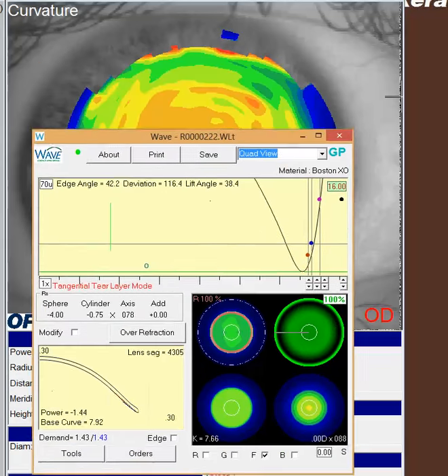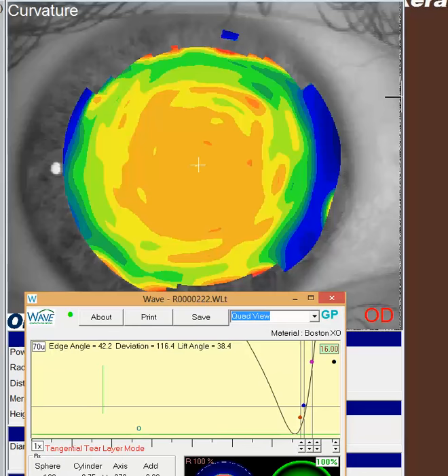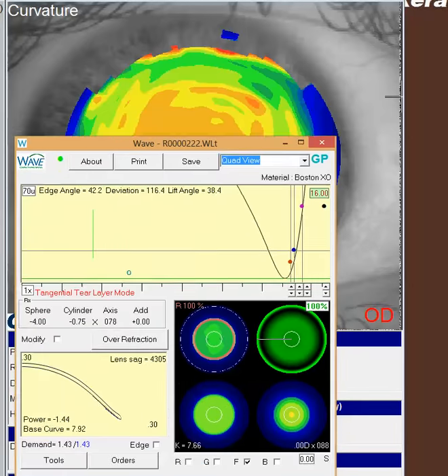So anyways, I wish you well with this case. It's a challenging one. These large pupil cases are always a bit of a challenge. But think of a post-operative PRK or post-operative LASIK patient as a better example of a patient who has large pupils. Think about it in those terms, and that might get you there a little bit faster.